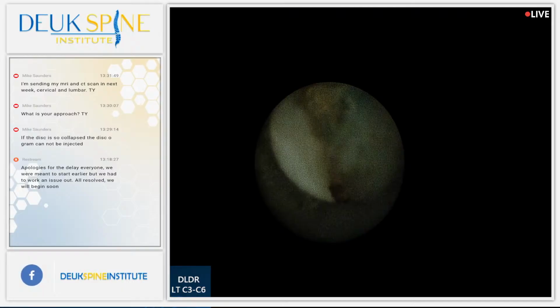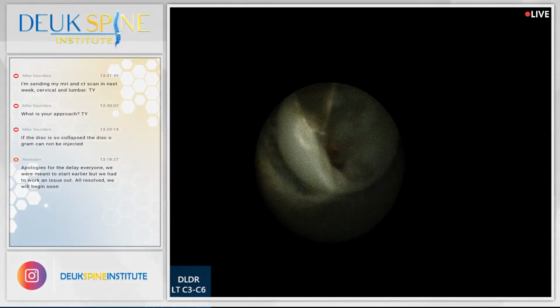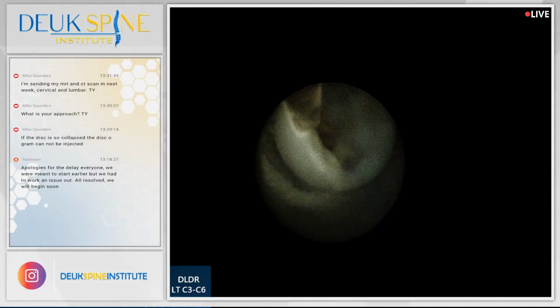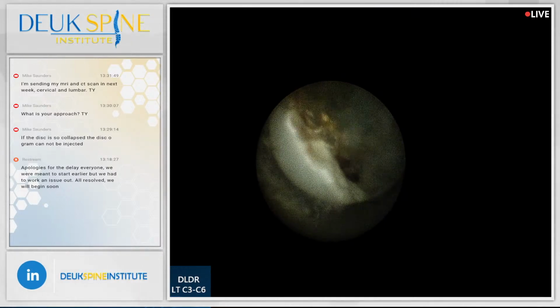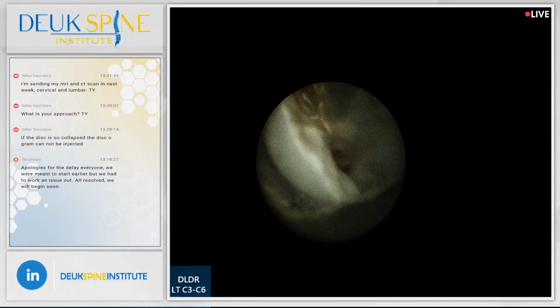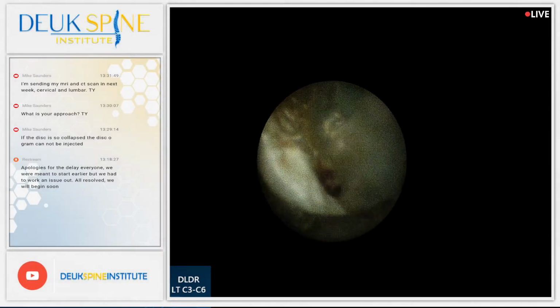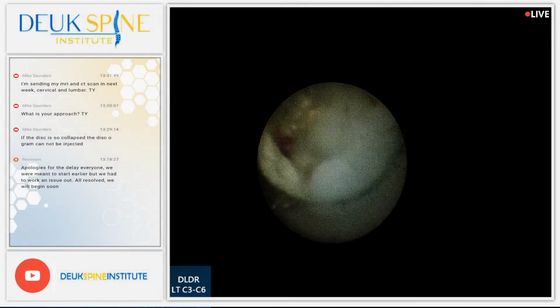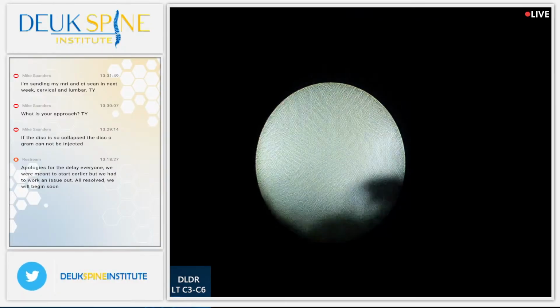This is the annulus right here. It's obviously been torn wide open. There's some scar tissue and calcification right there. A little bit of bone spur developing right there. That's why it's blasting really bright when the laser energy hits it. It's like a flare or flash. That's actually the laser energy interacting with a bone spur.